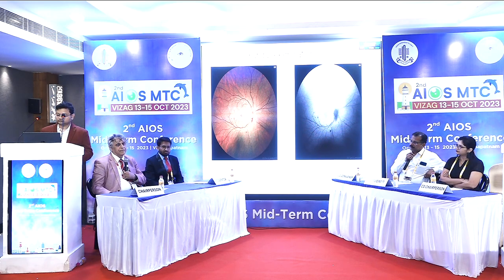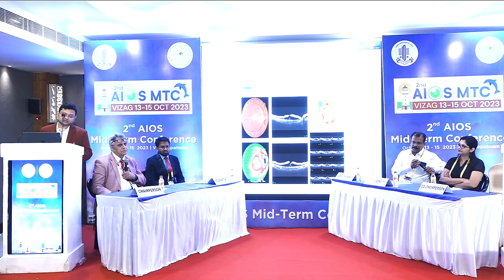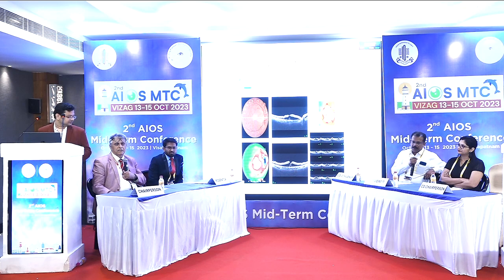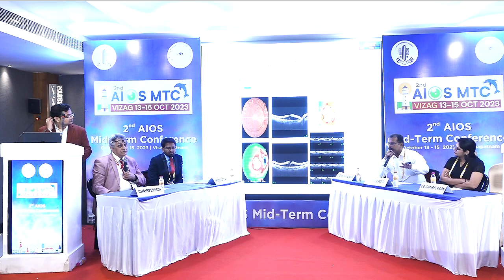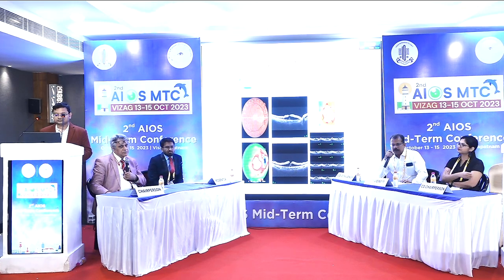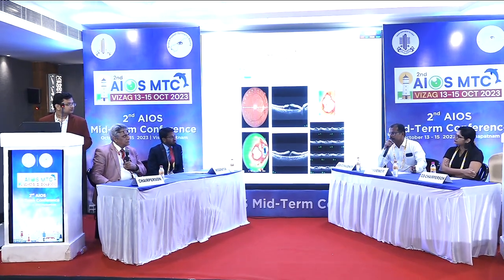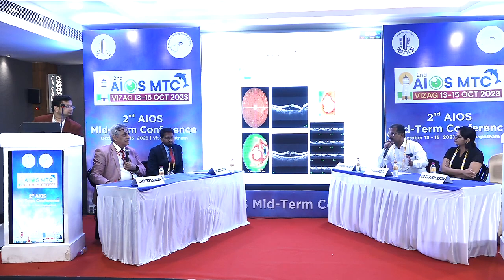Show the OCT. This is the OCT. There is subretinal fluid at the macula and around the disc also. But the arterial component, you see, normally there is a thickening of the retinal layers. This is very interesting because your section of the OCT is not going through the ischemic area. If it was going through the ischemic area, the whole layers would have been more opaque. The edema looks more like venous stasis, like a non-ischemic type of early central retinal vein occlusion.